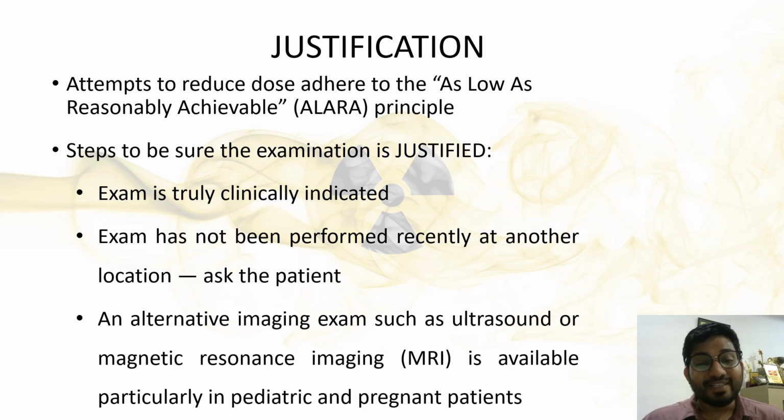include that the exam is truly clinically indicated. It should be justified. It should have a positive benefit. The exam should not have been performed recently at another location for the patient. And an alternative imaging examination such as ultrasound or MRI should be considered, particularly in pediatric and pregnant patients. We can utilize those modalities instead of giving excessive radiation.